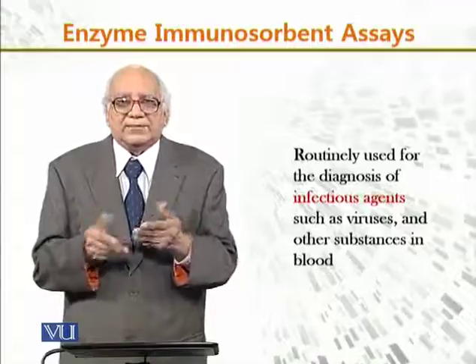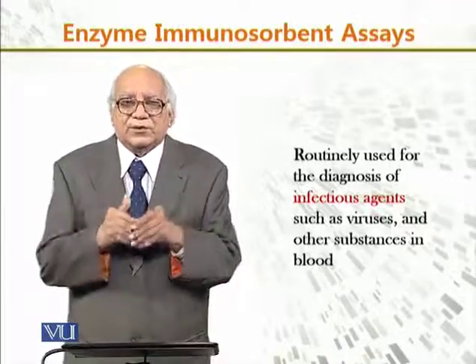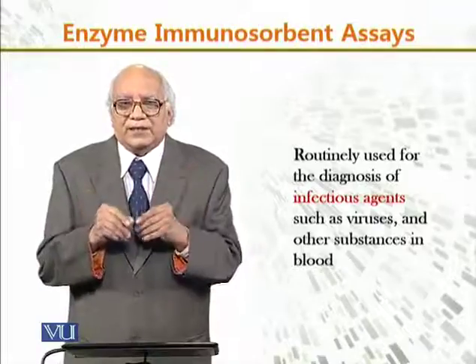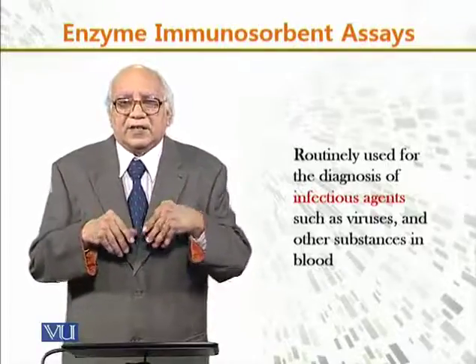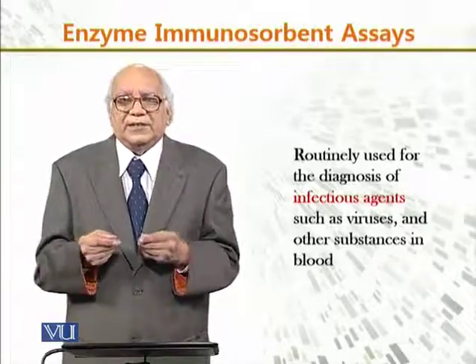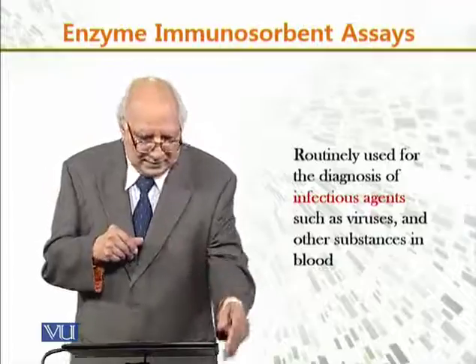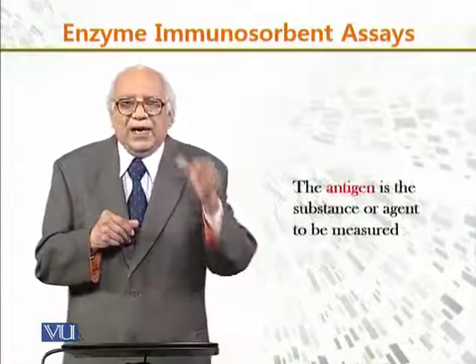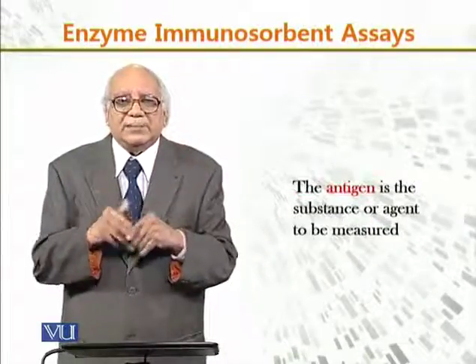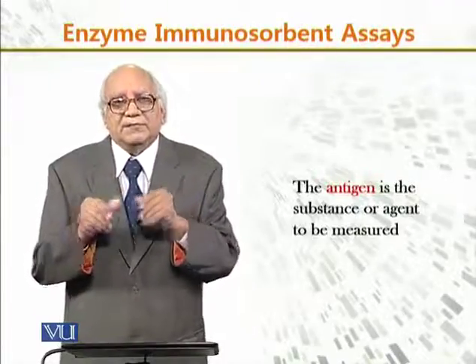This method is routinely used for the diagnosis of infectious agents such as viruses and other substances in the blood, and the antigen present is the substance or agent to be measured.